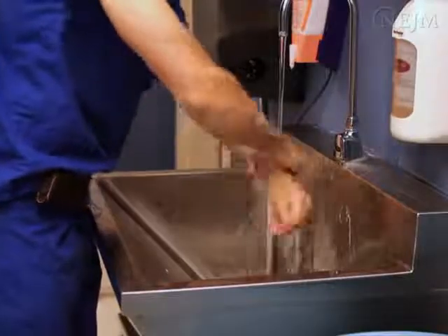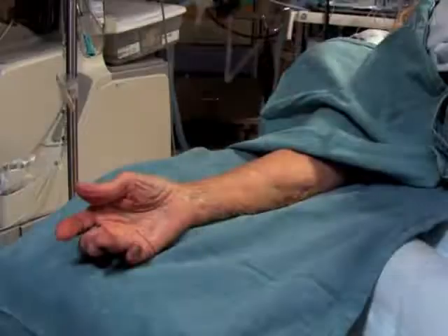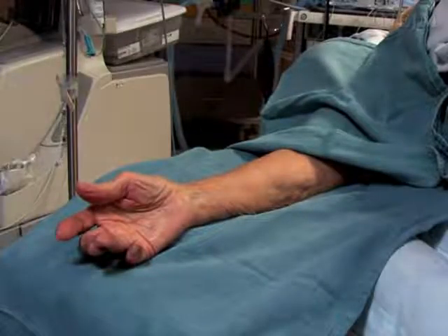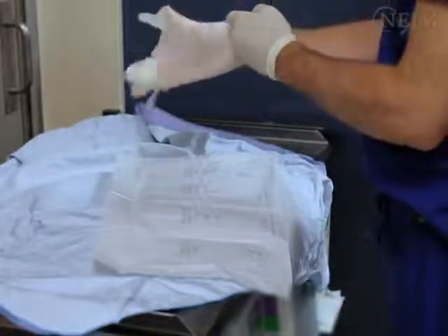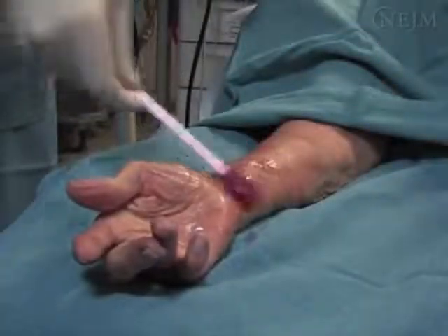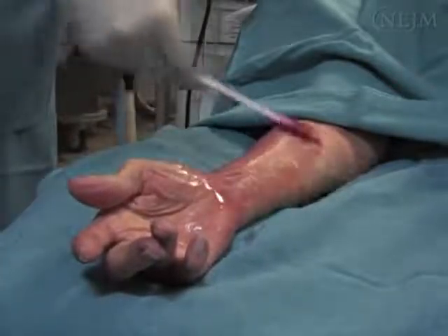Wash your hands before touching the patient and put on the mask. Position the patient's wrist so that the forearm is flat. Put on a pair of sterile gloves and use antiseptic solution to wash the skin of the patient's forearm from the wrist to the antecubital fossa.